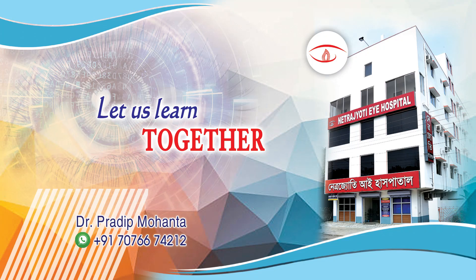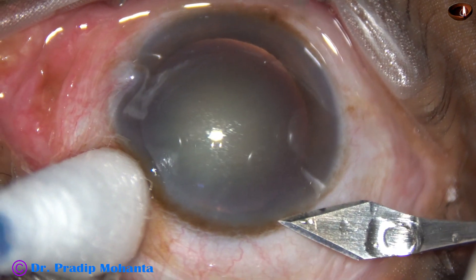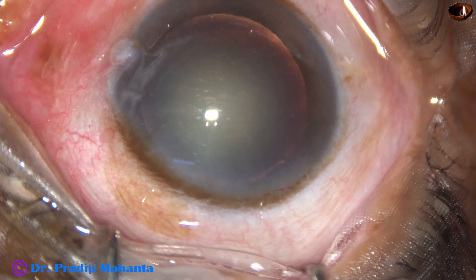Friends, welcome to my workplace at Ranaghat, West Bengal, India. In this video, we are going to watch phacoemulsification by Stop and Chop technique and Hybrid IA in two instances. This is the first case.